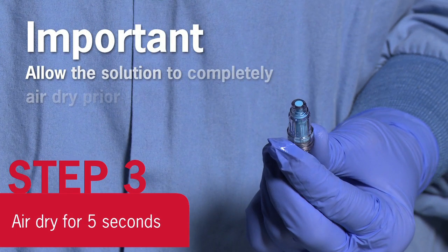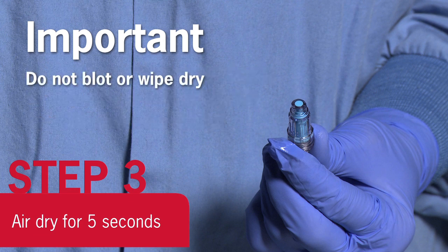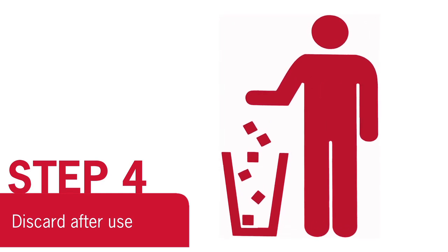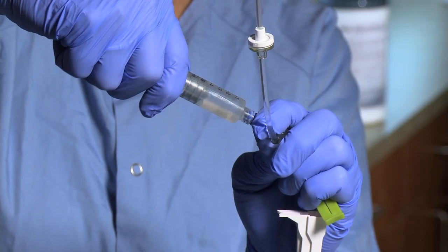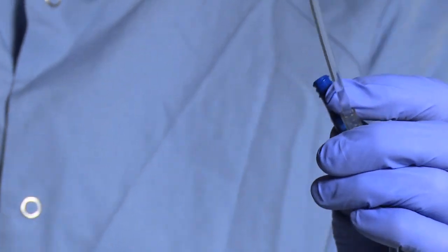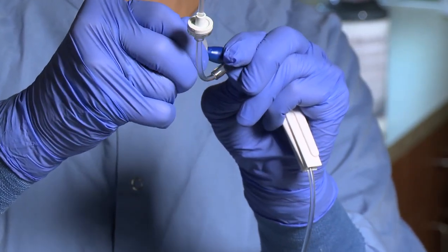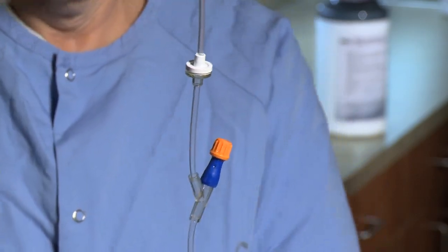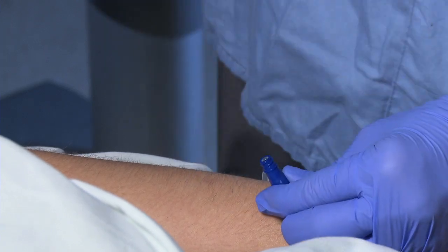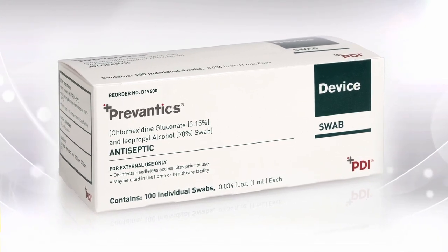It is important to allow the solution to completely air dry prior to accessing the needleless access device. Do not blot or wipe dry. Discard after single use. If your facility currently also uses impregnated caps for terminal line disinfection, the Prevantix device swab will complement this process. The Prevantix device swab is intended for disinfection of the needleless access sites between each individual access. When implemented as part of an evidence-based practice bundle, the Prevantix device swab can help reduce contamination of needleless access sites and improve outcomes.